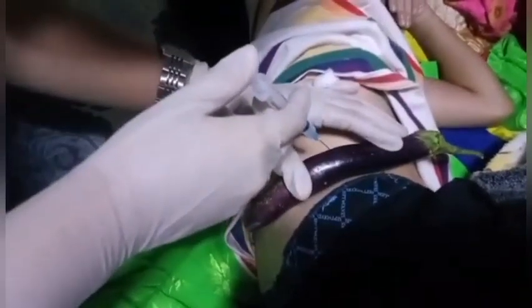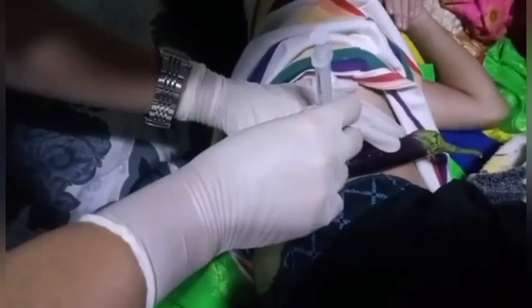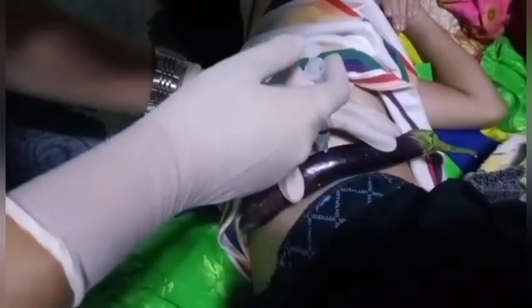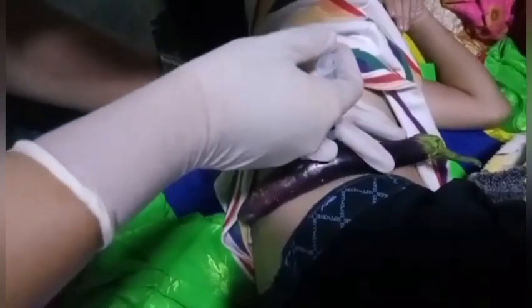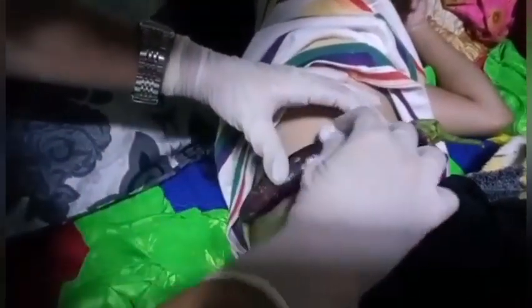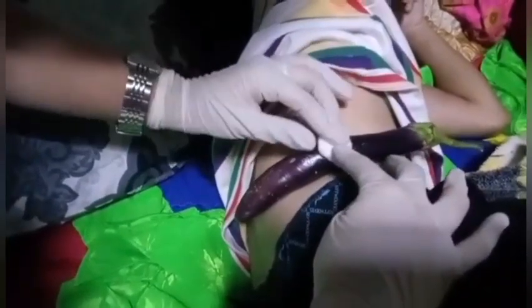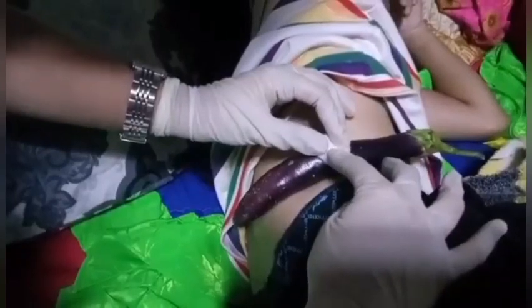Inject the medication slowly at the rate of 1 ml in 10 seconds and smoothly withdraw the needle. Release the skin and place the swab over the injection site. And apply gentle pressure but do not massage the area.